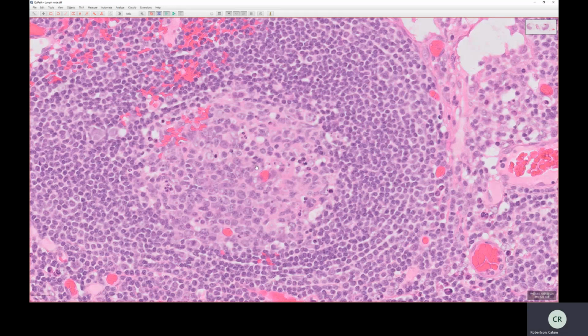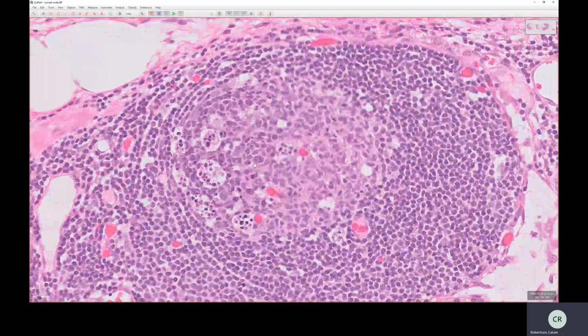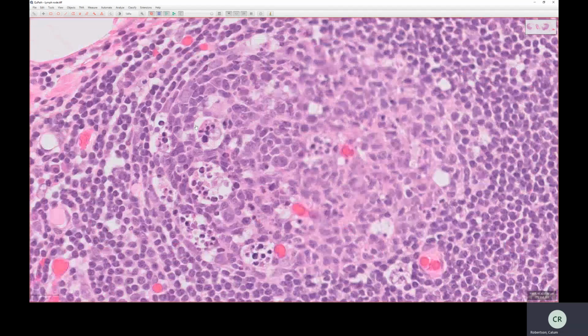and we will also see, let's see if we can find a better example. Here, oh, this is good. We also have another cell type. Now these cells are replicating really quickly. These are all being activated and they're mitotically active. But when the cells are mitotically active, very active, often mistakes happen. And if mistakes in replication have been identified, the cells undergo programmed cell death or apoptosis. And the debris then needs mopped up.